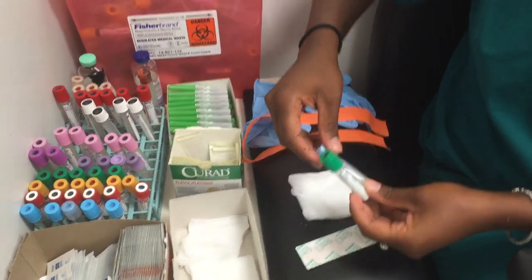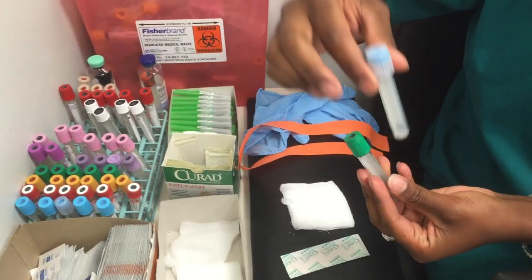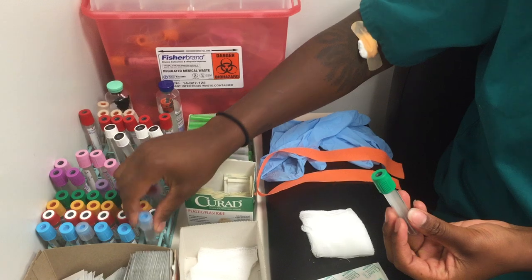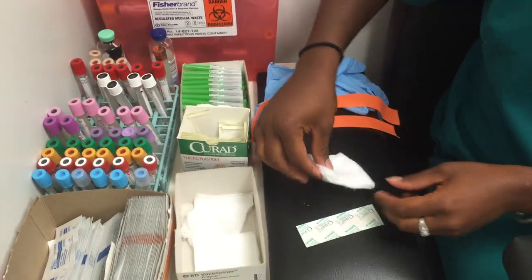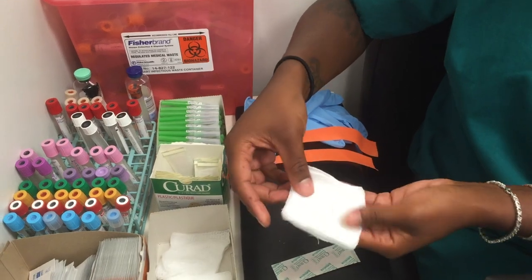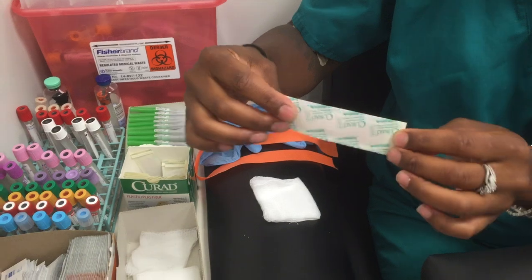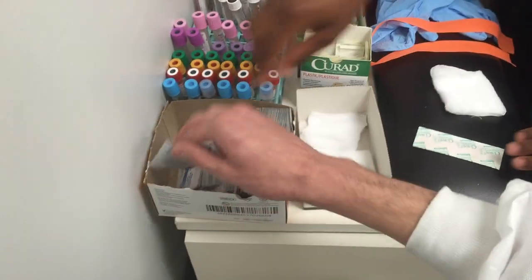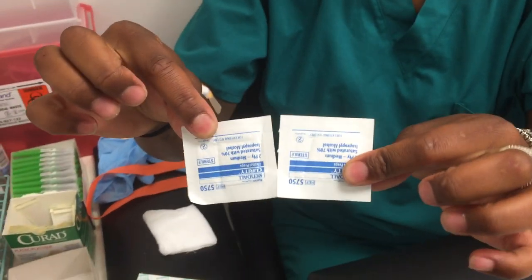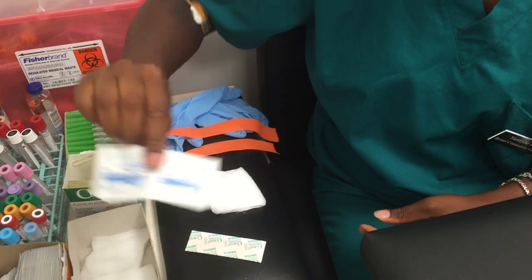Here is just an example — we have a green top tube and a light blue tube. Here we have some gauze to stop the bleeding after the procedure, and also a band-aid. We also have alcohol wipes to sanitize the site before the procedure. Make sure to do it in concentric circles.